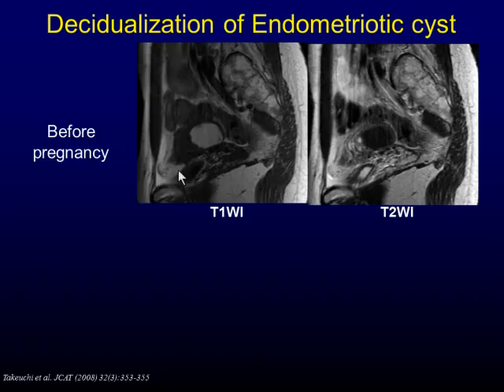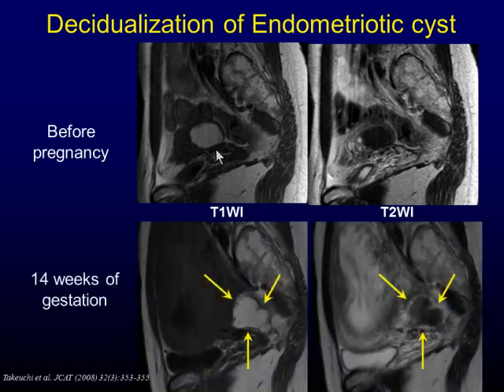In the influence of progesterone, such as during pregnancy or progestin therapy, a decidual change of endometrium in the endometriotic cyst can occur. In this image taken before pregnancy, a small endometriotic cyst is found. During pregnancy, after 14 weeks of gestation, the decidual tissue is found as mural nodules. It looks like ovarian carcinoma, but high signal nodules with signal intensity similar to that of placenta is a characteristic finding of decidual change.